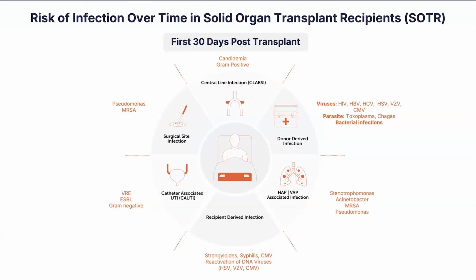However, sometimes the donor or recipient can have some hidden infection, which may surface with heavy immunosuppression that you didn't anticipate, and they can get really sick. So you send all these conventional testings and you don't really know what's going on, they're negative. So in that small subset in this period, really doing Karius testing may be helpful.